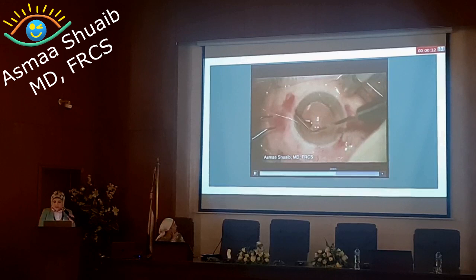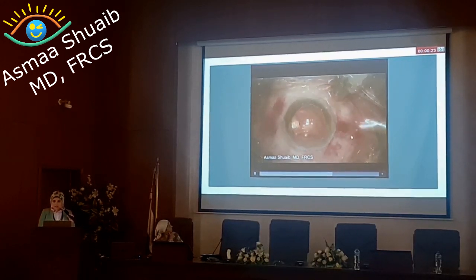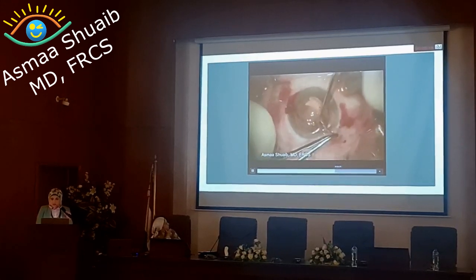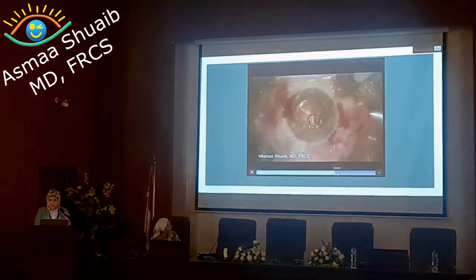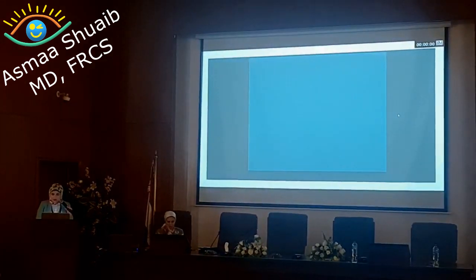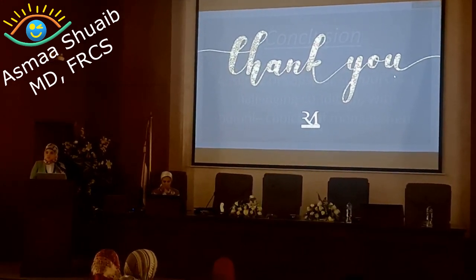Now, after that, you pull both sides. You can see that the IOL is perfectly centered, and here we have the sutures to which the haptics are fixed. And in the end, you can pull the sutures outside the eye and tie them to get the IOL perfectly centered and fixed. So here we can say that cases of absence of capsular support are challenging cases, but you have multiple options to solve this problem. Thank you.